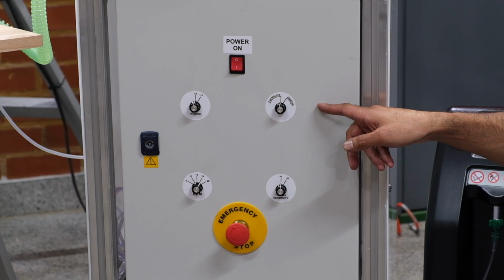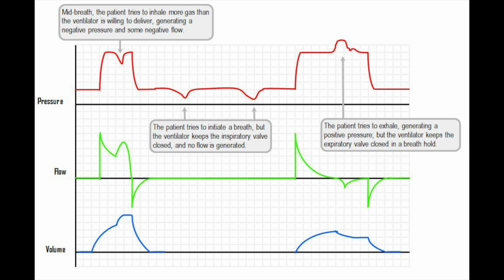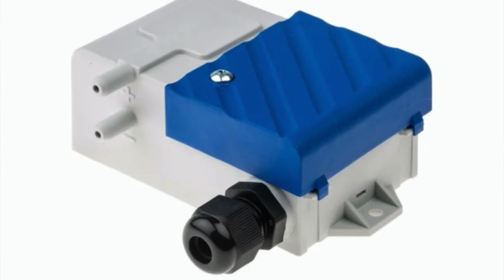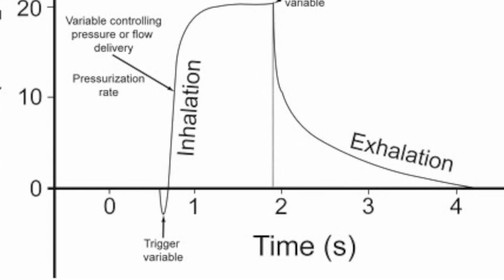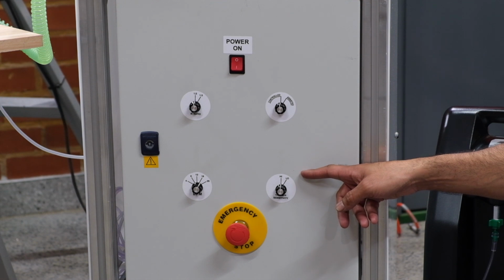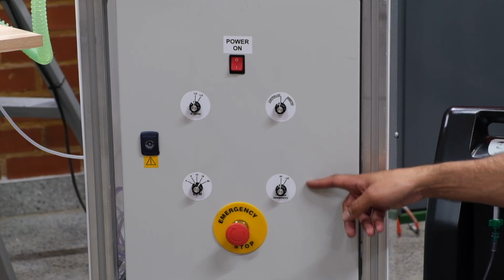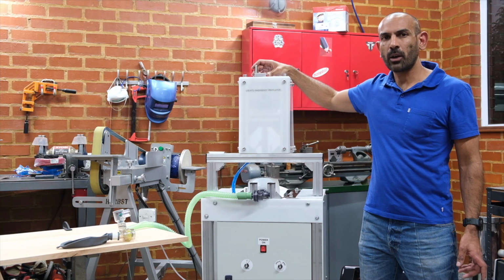That's a big change. Because what happens with manual ventilators is you get, in control mode, patient-machine asynchrony. So we breathe at an inconsistent rate and the machine performs at a set rate, and then it becomes very uncomfortable for the patient. So with an assisted mode, you now have a pressure sensor, and as the patient takes that breath, it triggers the ventilator to complete the breath for the patient. So you can set that trigger sensitivity to either high, which is -1 centimeter H2O, or low, which is -2 centimeters H2O.